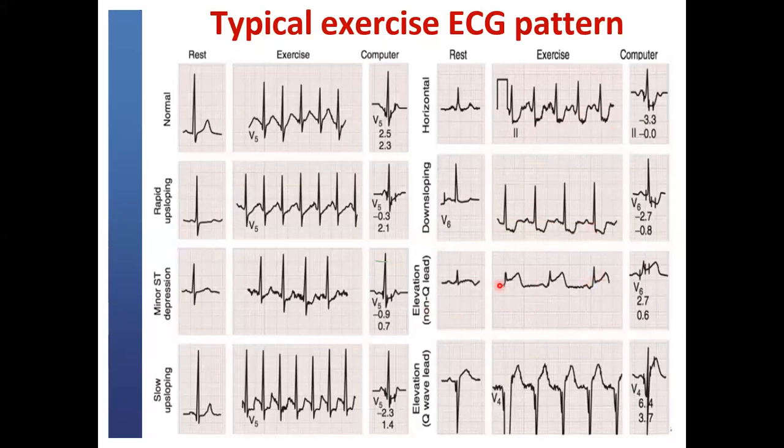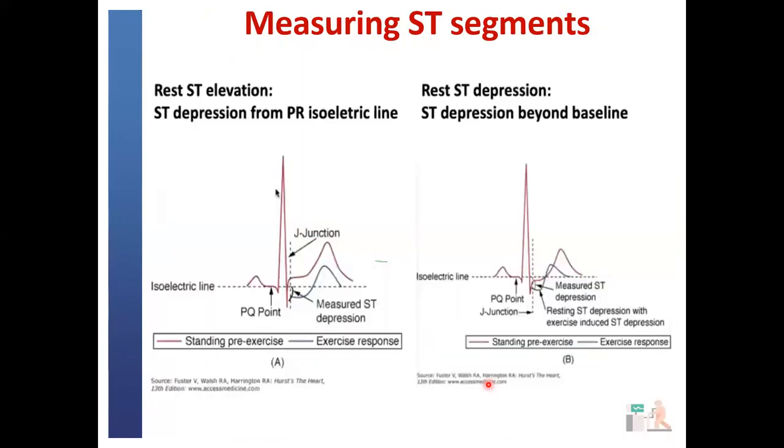Then elevation in a non-Q wave ECG: at rest, you cannot see any Q wave here. So by the time you are having this elevation of more than 1 millimeter, this is diagnostic. But this is a Q wave lead. There's actually an elevation here, so this cannot be considered diagnostic on an exercise stress test.